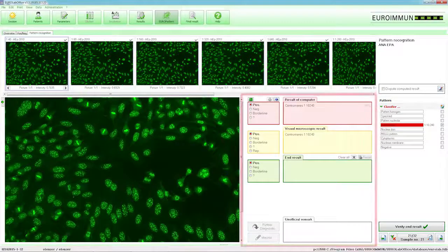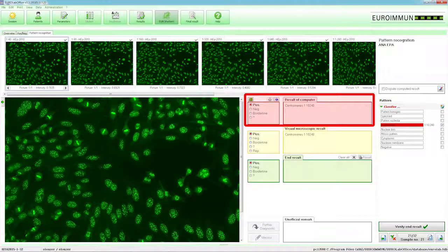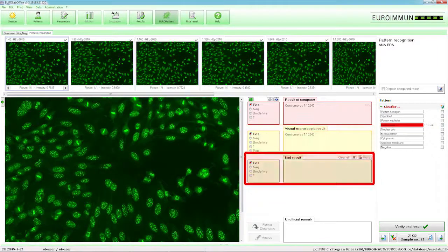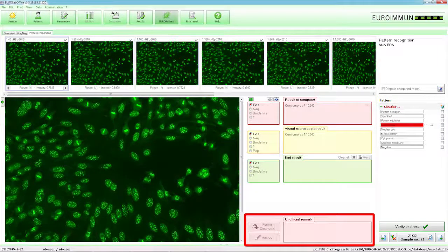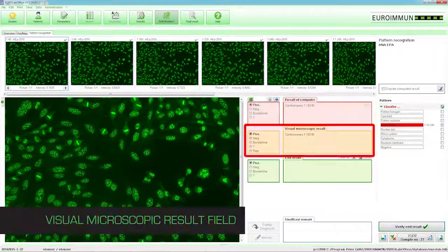In the Results area to the right of the magnified view, four differently colored fields are displayed: result of computer, visual microscopic result, end result, and unofficial remark. The computer result field displays the automated result generated by the Europattern classifier.